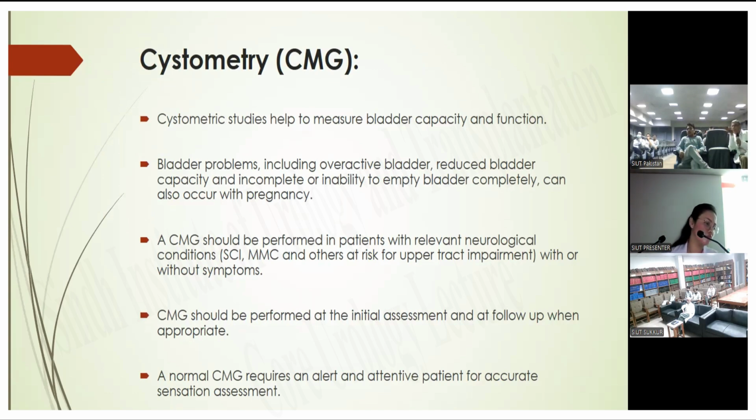But the person doing it should be an expert, because in children our pediatric team is doing urodynamics. It is not easy to perform urodynamics in small children, but they are doing it, and they have generated the system and process for doing it. So I think if a doctor or expert is there who is reading it and applying it on patients, then that will be possible as well for those patients where there are these difficulties.